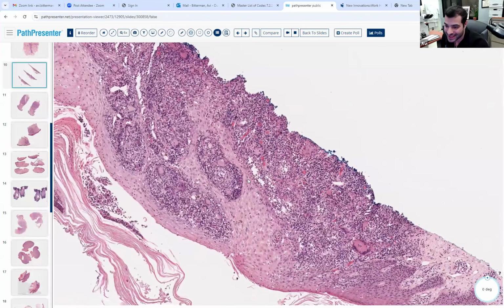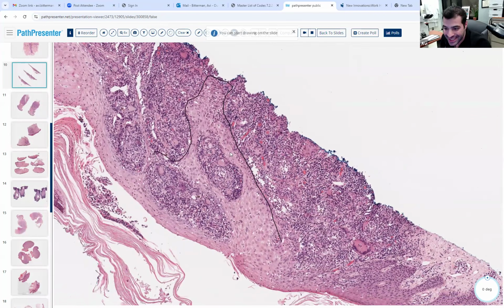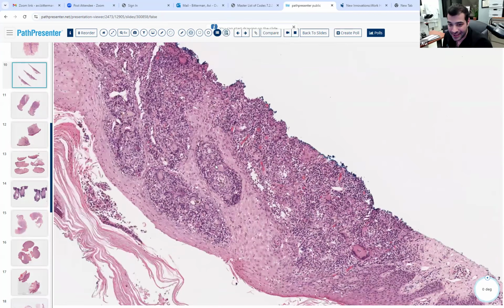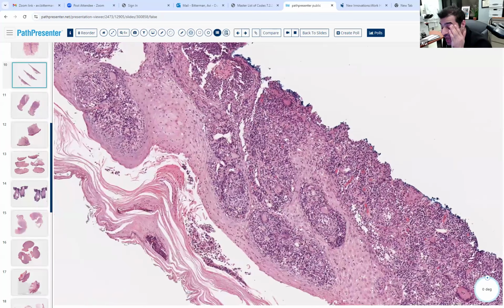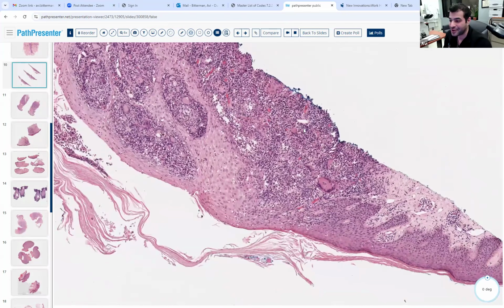And by the way, what else is there in this biopsy? What's going on with all this epithelium? It's penetrating deep down, stretched out, pointy. Is it cancer? Does the patient have a cancer now? Would we call this pseudoepitheliomatous hyperplasia? Yes, this is a reactive phenomenon to the suppurative granulomatous dermatitis.